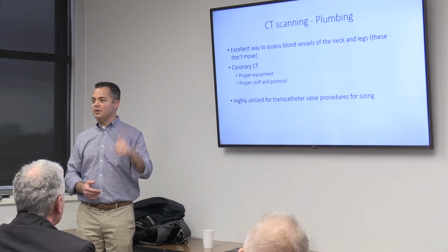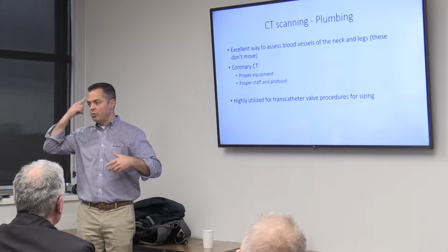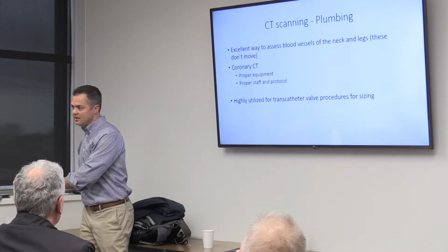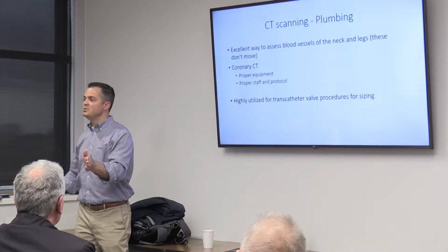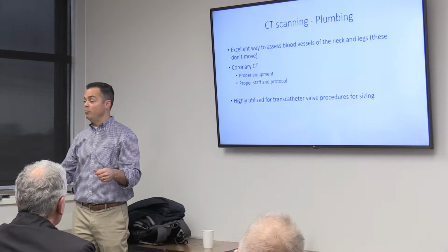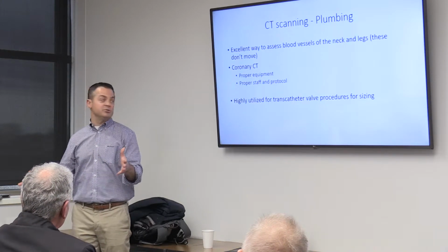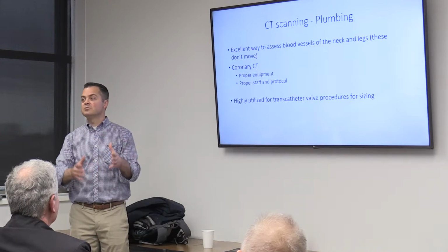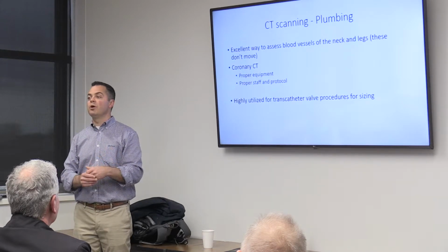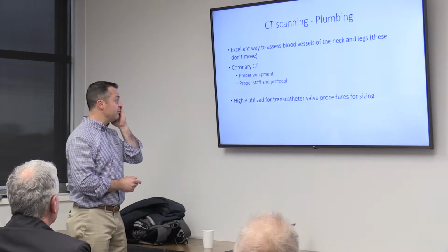You go try and do one of these on a CT scanner sitting in the emergency room where they're doing, you know, bellies and brains all day long. I mean, a CT tech is not a CT tech is not a CT tech. It's like a doctor. You wouldn't go see me because you want a new knee, okay? That would be silly, okay? Are me and the orthopedist both doctors? Yes. But we have different specialties. So a CT tech who works here with people who take pictures of blood vessels all day knows how to acquire the right images.